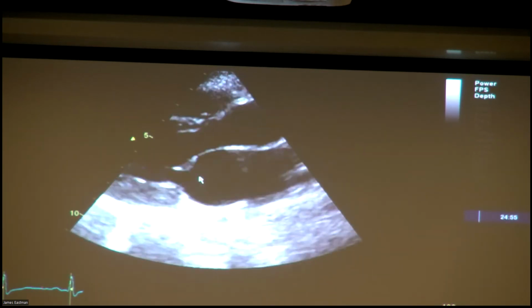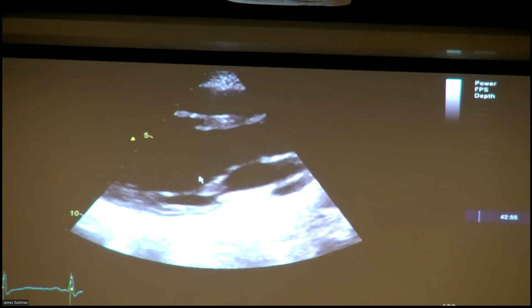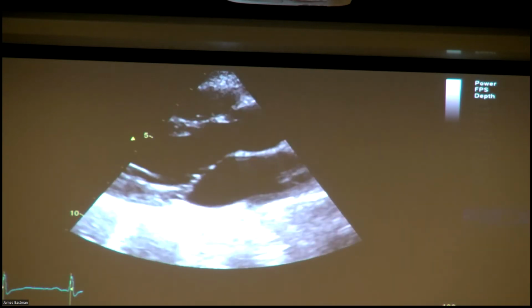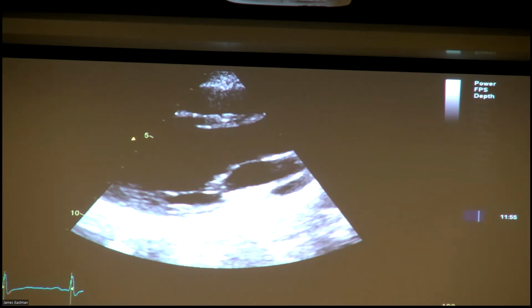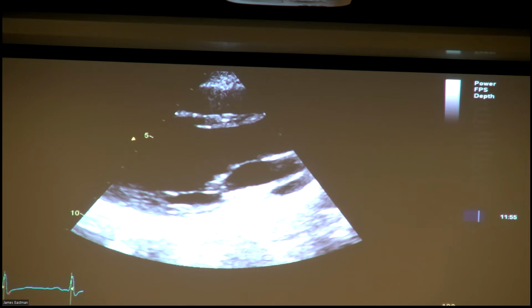What we're looking for is maximum diastole and maximum systole of the left ventricle. I'm going to cycle through my small video and get the left ventricular internal dimension at its biggest, which is like this.